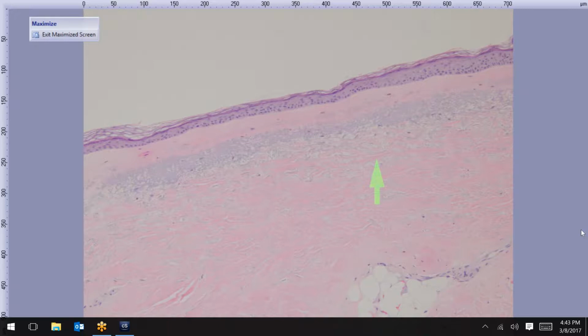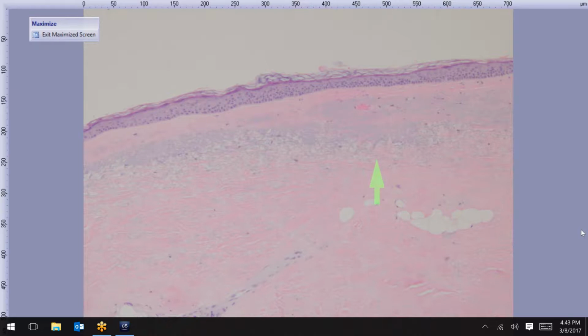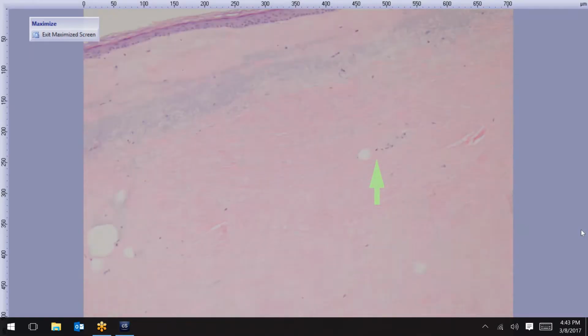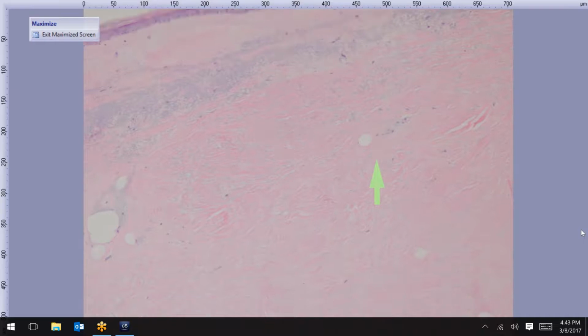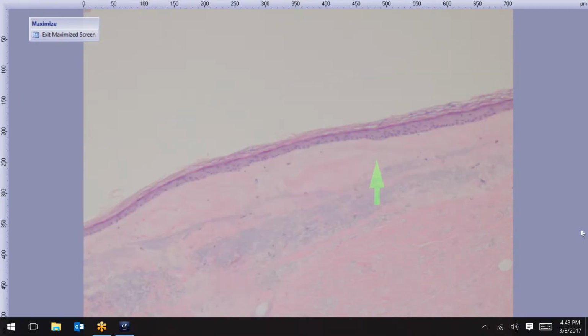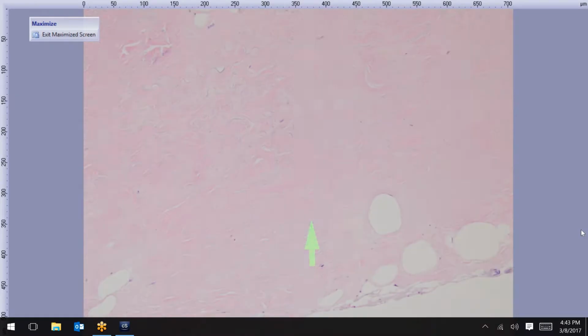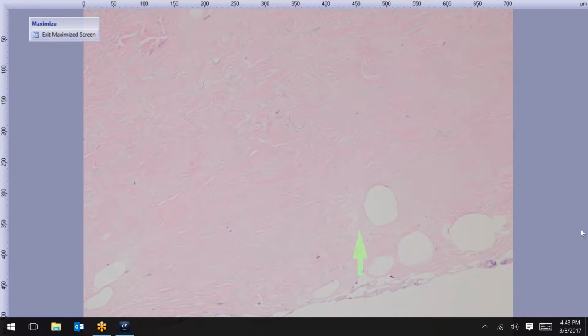Sclerotic. And as someone mentioned, radiation dermatitis, which this is. So this is chronic radiation dermatitis. And the main features, as opposed to the lichen sclerosus et atrophicus that we saw earlier, where the sclerotic area was pretty much limited to this area, and then there are some lymphocytes underneath, well, you see that the sclerosis extends all the way down here. So it just isn't part of LSEA.